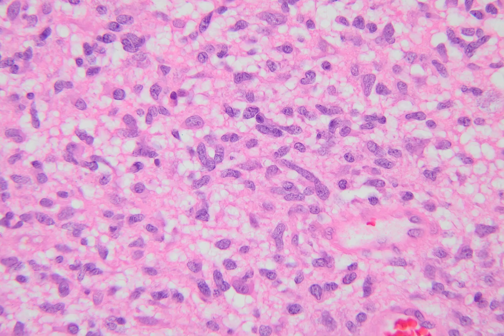The nuclear features shown here are characteristic of astrocytic differentiation. One way to think about glial nuclear features is to use a food analogy. Oligodendroglial cells have nuclear features similar to an orange, referring to the ovoid shape of the nuclei. In contrast, astrocytic cells have nuclear features more in keeping with an Idaho potato.